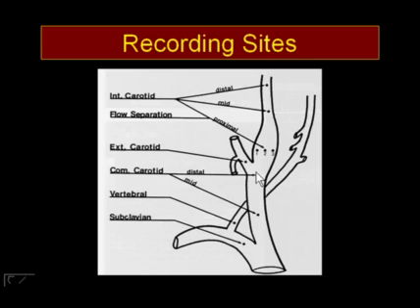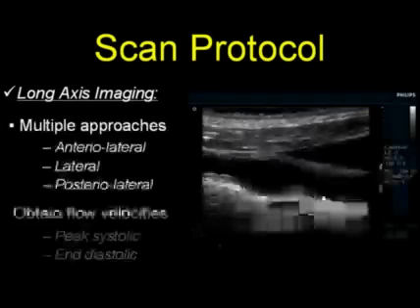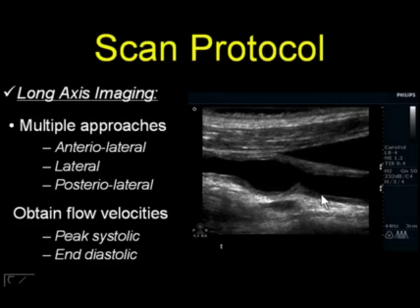And also keep in mind that the number of images acquired will vary according to the specific laboratory protocols, which gives me an opportunity to mention that every laboratory should have a written protocol in place. This is important because it promotes consistency from one study occasion to the next. It's also very important in labs that have more than one technologist on staff. We need to know that we're doing the same thing from patient to patient. So it's important to have a written protocol in place.